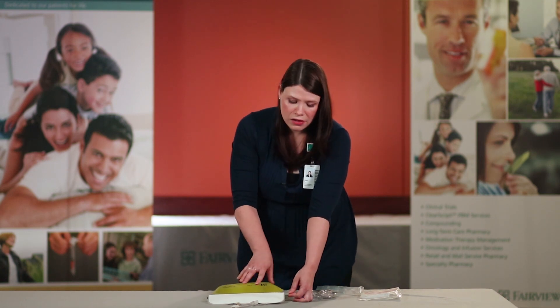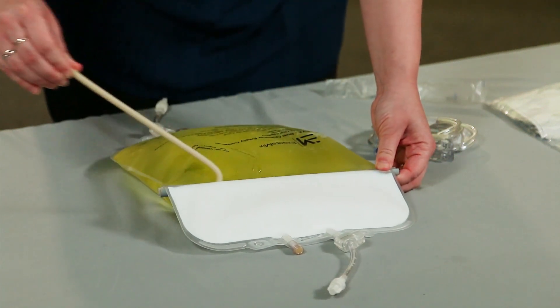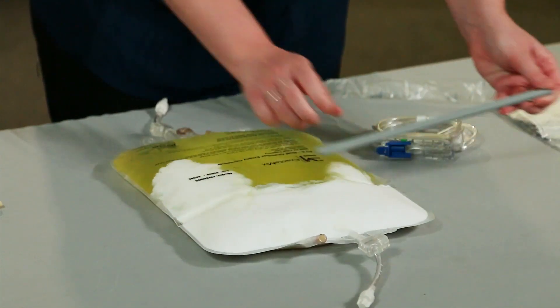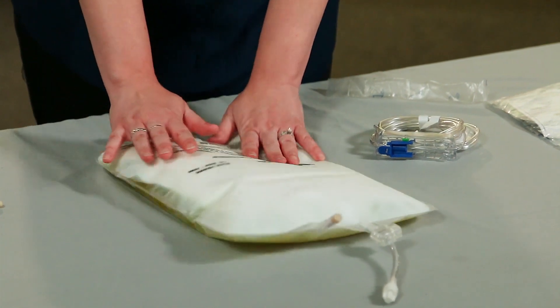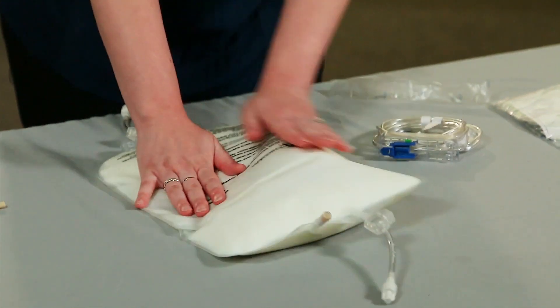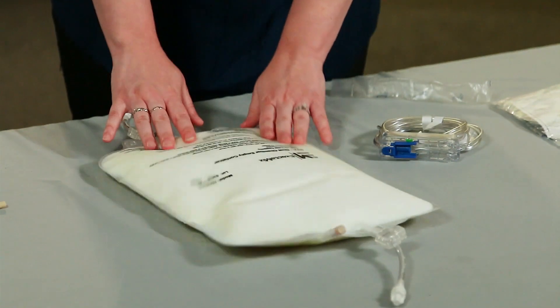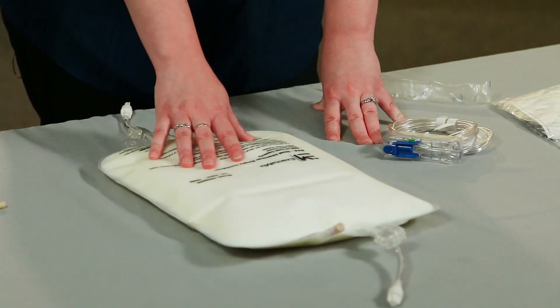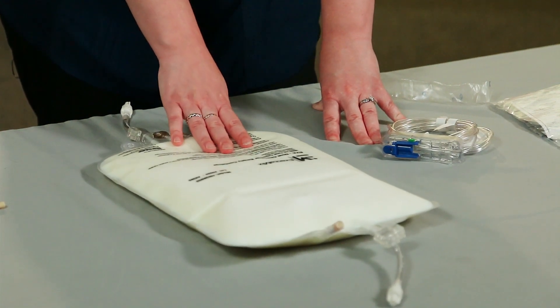To mix your bag, pull the rubber stopper and remove the silver backing. You can see that now the lipid is mixing with your other portion of TPN. Gently knead the bag to ensure that it is all mixed correctly. Once again you want to inspect the bag. If you notice any cracking, or if it appears oily, or if there are any streaks in your bag, you do not want to use this bag — call Fairview Home Infusion.